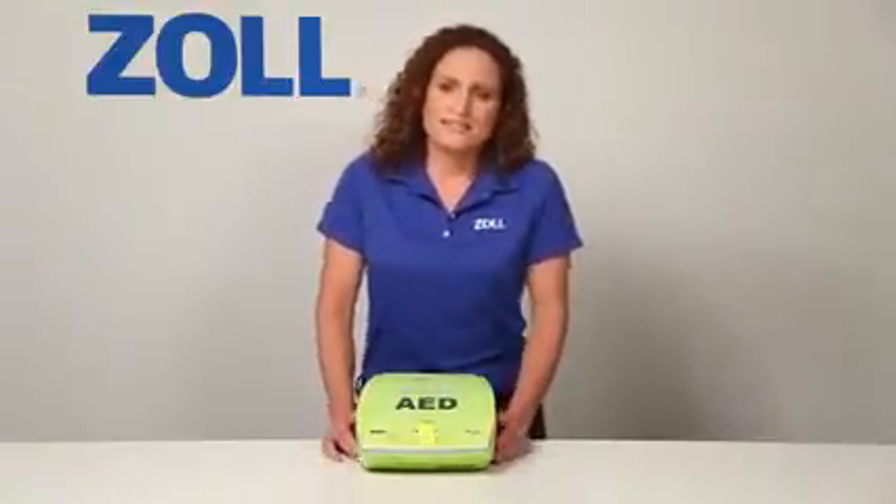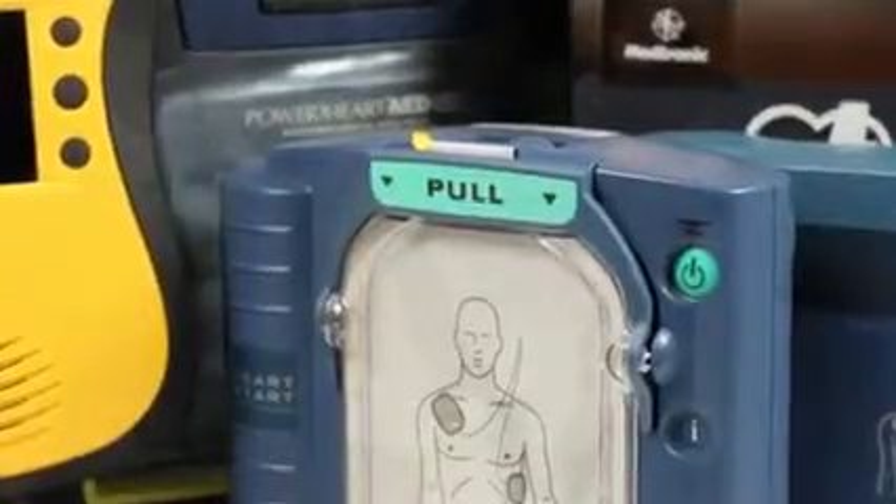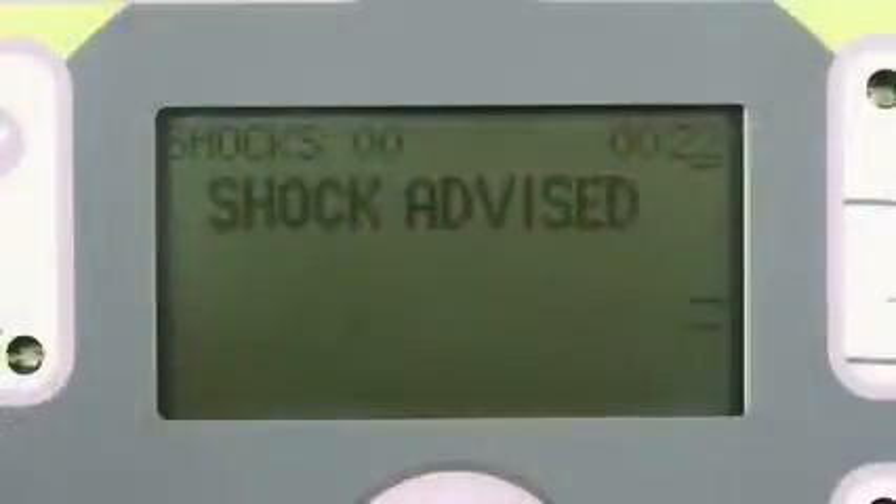Actually, most don't. At best, they only help about half the time. Does that mean that half the time when you push the shock button on another AED, it won't deliver a shock? No. Other AEDs can shock just fine, and so can the AED Plus.